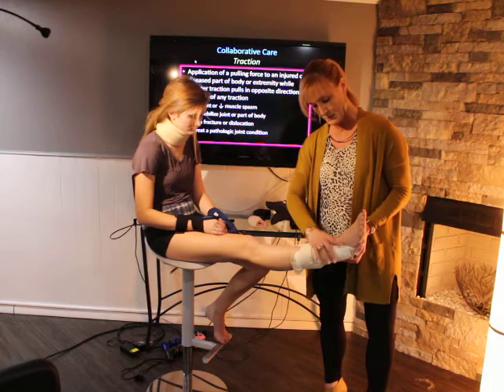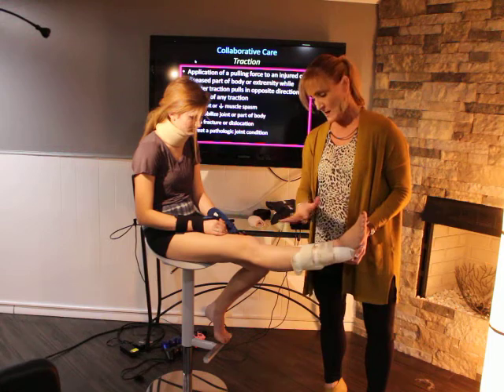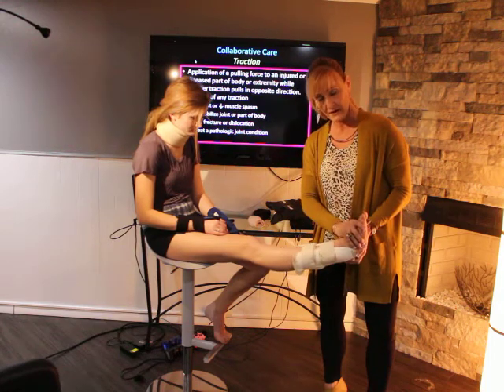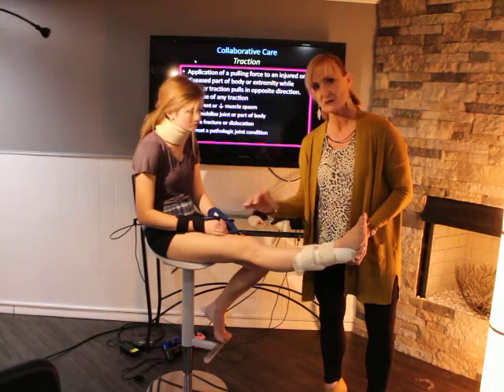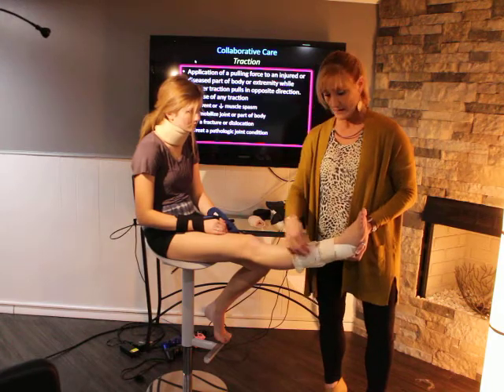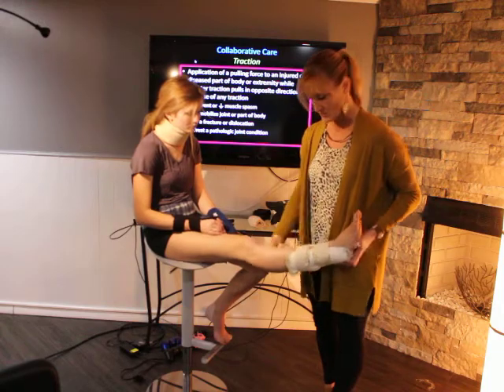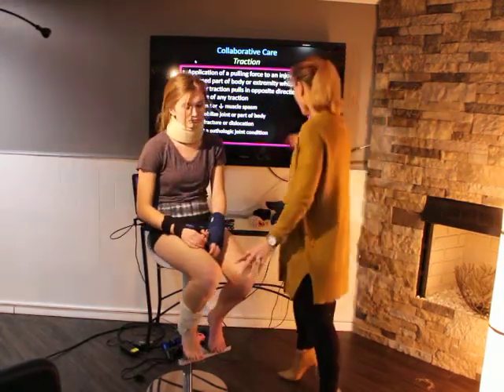So again, I'm going to probably send this patient home from the ER with something like this on. Have the patient lay down on the couch, elevate, ice, Motrin, probably go back and see the orthopedic surgeon within the 24 hours. Hopefully this swelling will go down and they can actually cast it with a permanent hard cast. So these are called splints or tongs. You're going to see a lot of those in your patients who have bone traumas.